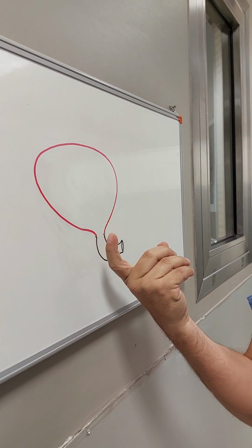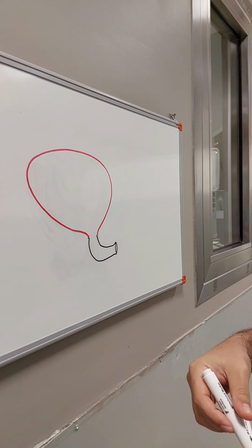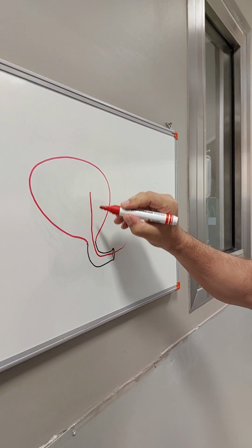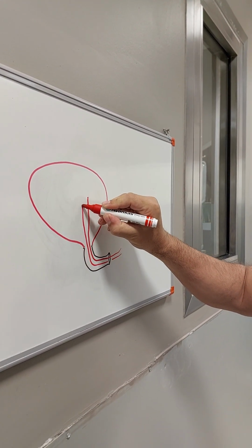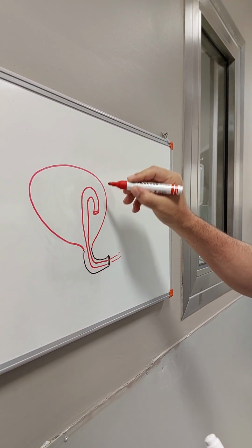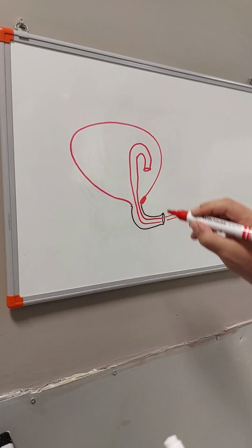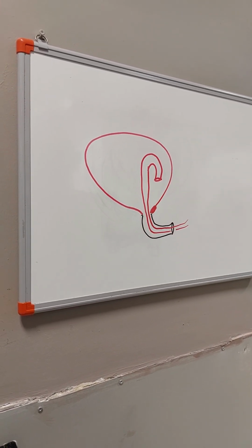The urethra is like this curved shape, and when we go in with the flexible instrument, it goes inside and takes the shape of the urethra, and it can turn, bend on itself, and see from upside down. So we were noticing there is some tissue missing here. We couldn't fulgurate this area. Then I noticed that it is happening like this.